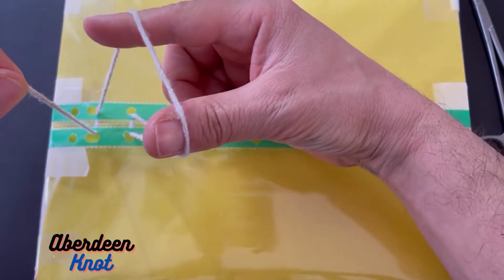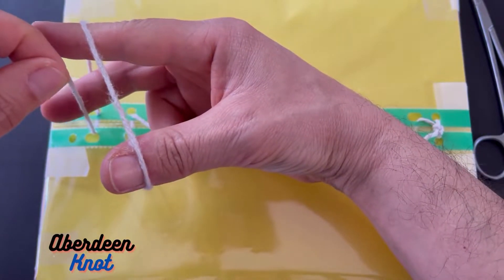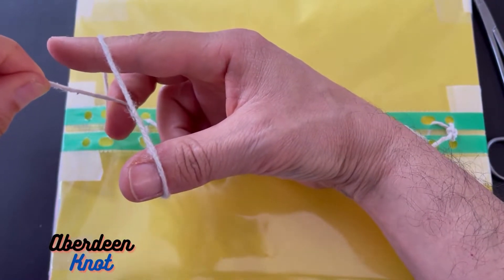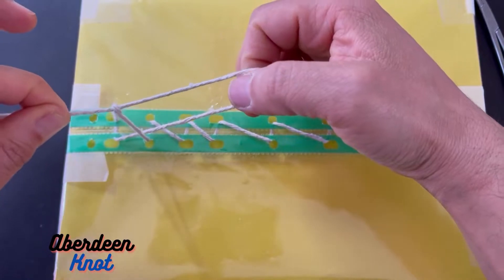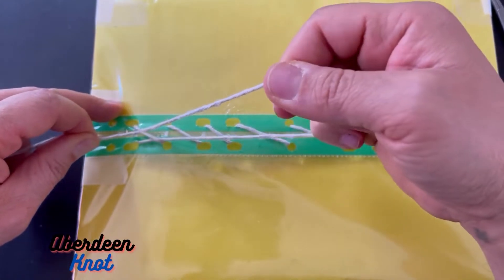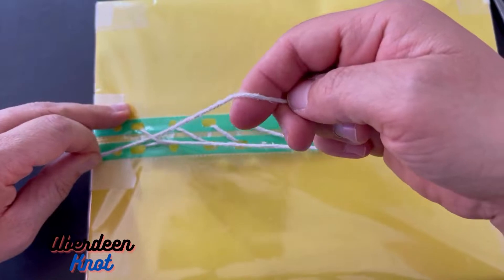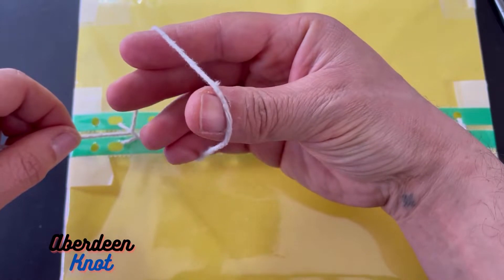Now we have a triangle between thumb and index, and middle finger in the middle. Middle finger goes in and pulls this towards us — without leaving the other hand, we're still holding it. Keep pulling, keep pulling until we're laying the knot down. Once that's done, again there's another loop — now it's a closed loop.